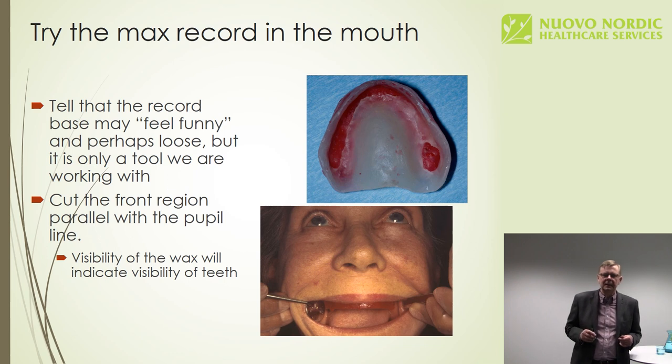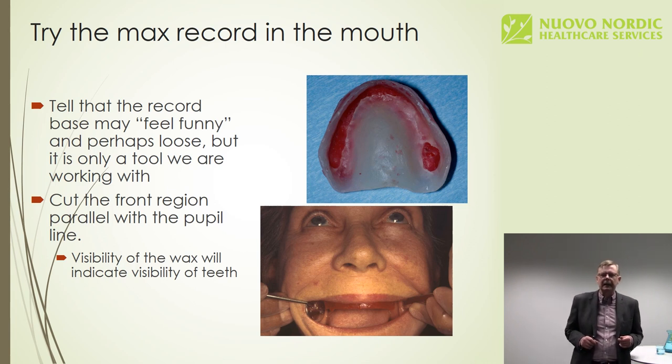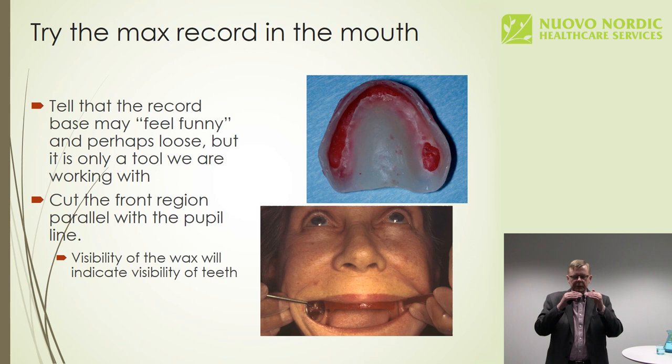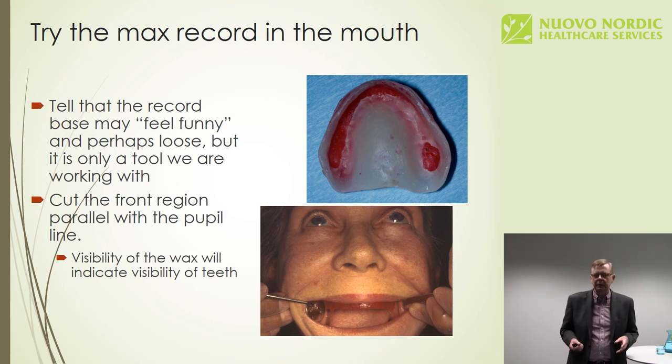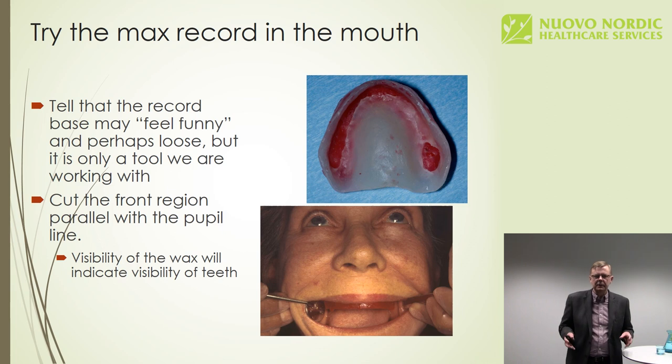So, with the maxillary record, you first define the visibility of the becoming front teeth, the support of the lip. You'll define the midline, and you first cut the front region of the wax rim horizontal, parallel to the pupil line, and scribe the midline. As I mentioned, the visibility of the wax will indicate the visibility of the teeth, so you will adjust the height.